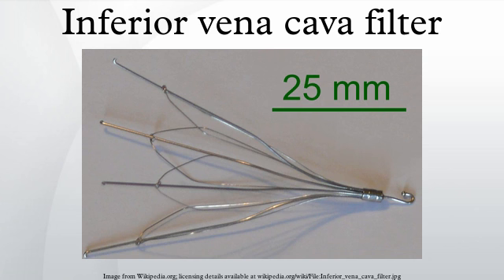Retrieval. The concept of a removable IVC filter was first thought up in 1967. However, it was not until 2003 and 2004 that the United States Food and Drug Administration drafted regulations and requirements on creating devices that were fit for retrieval from the vena cava. And still, even while the FDA did approve of the models and designs, it wasn't until 2005 that the Society of Interventional Radiology convened a multidisciplinary conference to address the clinical application of non-permanent vena cava filters.